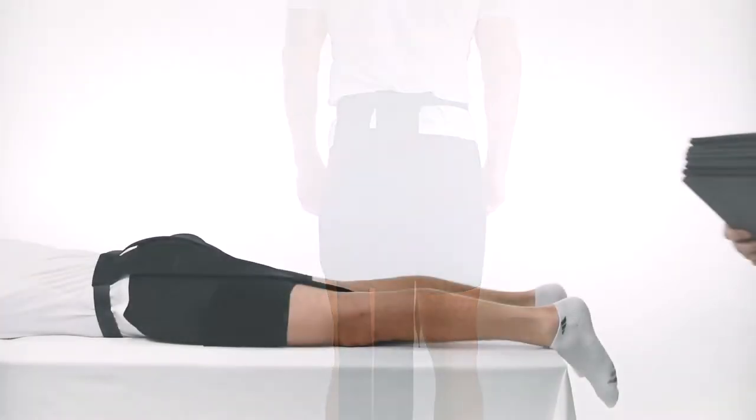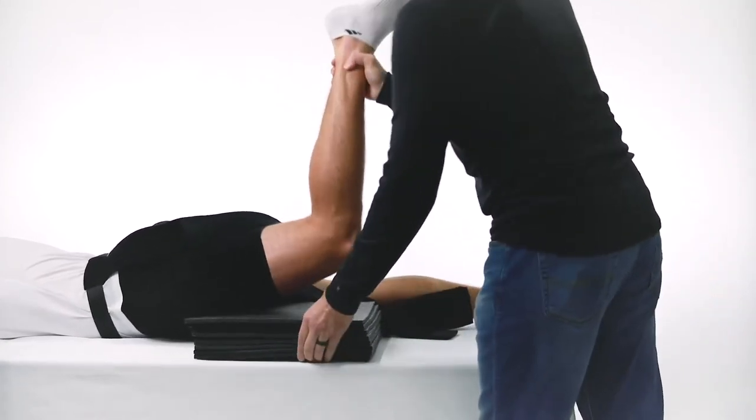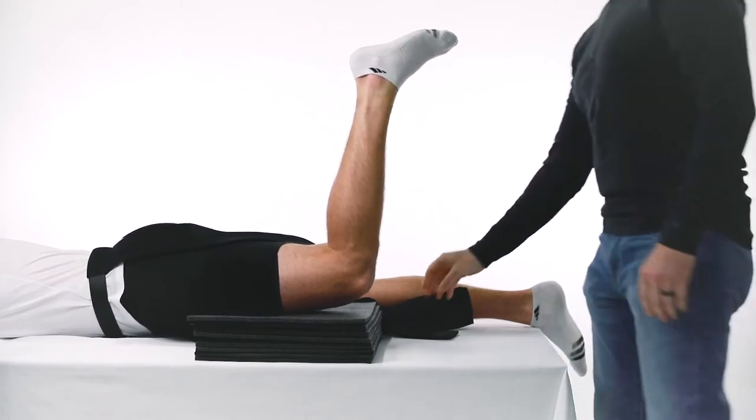Position the subject face down on the training table with a pillow under the knee of the affected leg and flex the leg at a 90 degree angle.